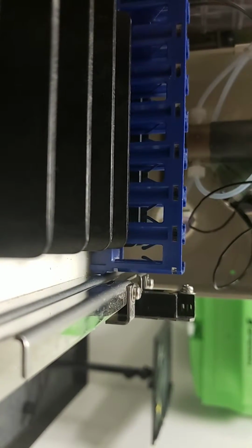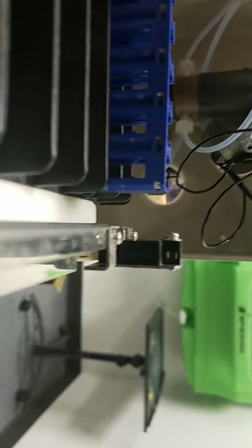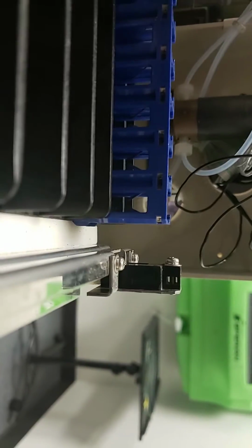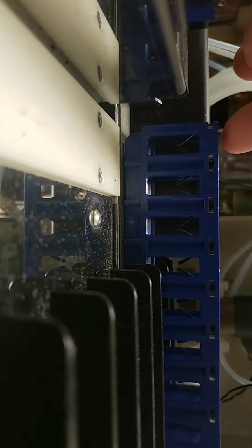If it's too high, then this will pick it up and basically cause it to jam against the front of this, like it'll actually hit the front of that white piece. If it's too low, it actually will let the belt spin underneath it. So you can see right there's a little bit of a gap there. I'm not too much of a fan on that.